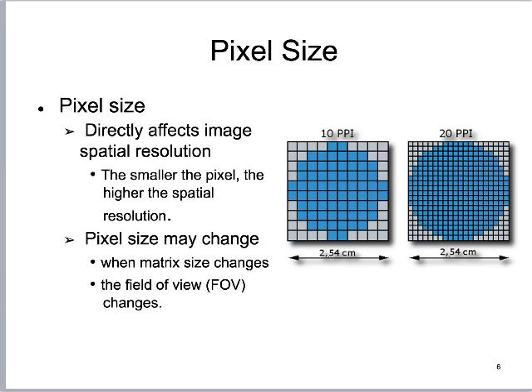So what I'm saying is, on a digital system, not only does decreasing the field of view or the exposure area reduce patient dose and improve image contrast, I'm also saying for a digital system it reduces pixel size, so it enhances spatial resolution.